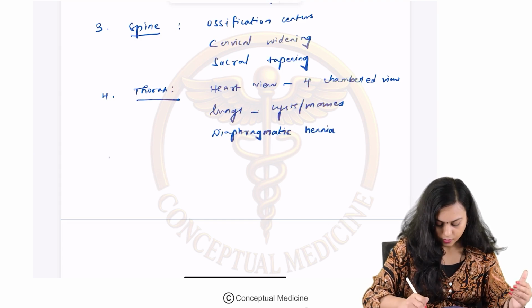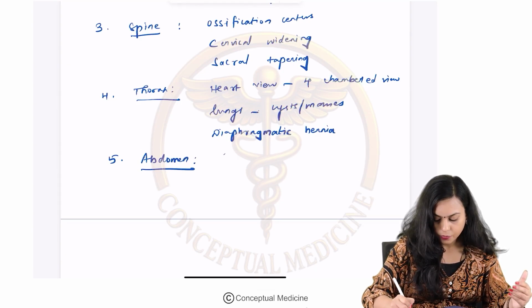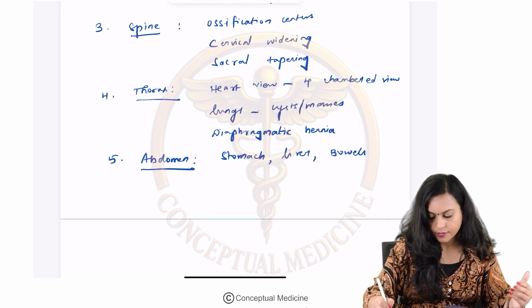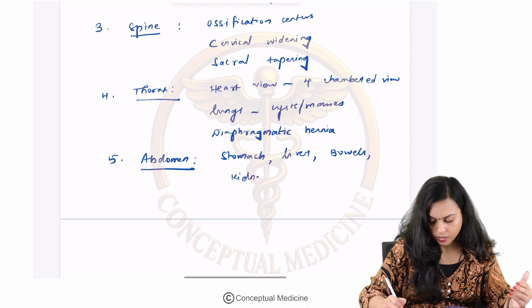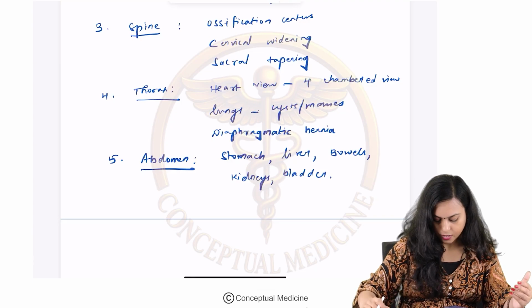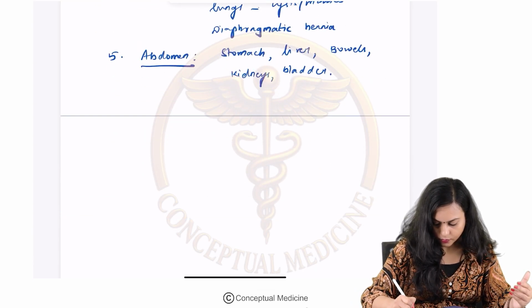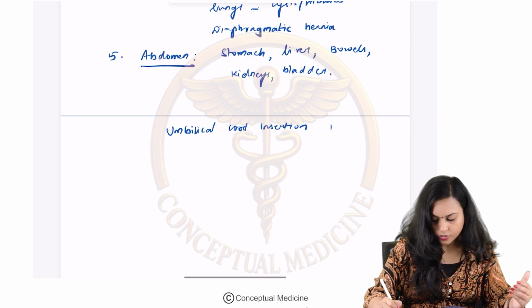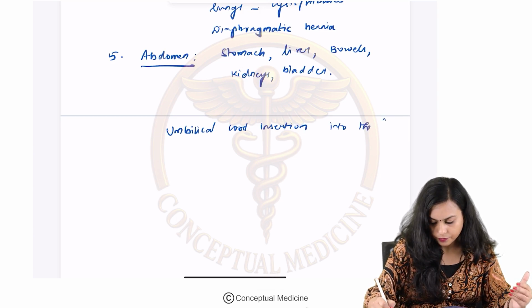And then in the abdomen, you have to see how is the stomach, liver, the bowels, kidneys, bladder, and also the umbilical cord insertion into the fetal abdomen.